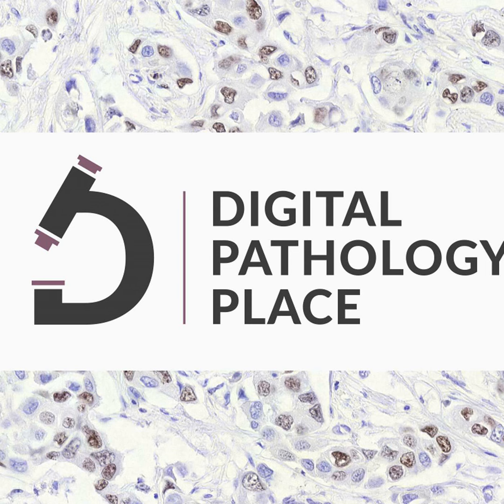The immunofluorescence still has some limitations due to the way that the microscopes or the scanners take pictures. And so there are some techniques called spectral unmixing that can be used to remove a lot of the background or crosstalk that can happen in immunofluorescence. And the spectral unmixing techniques get you to about 9 different biomarkers on the same piece of tissue.